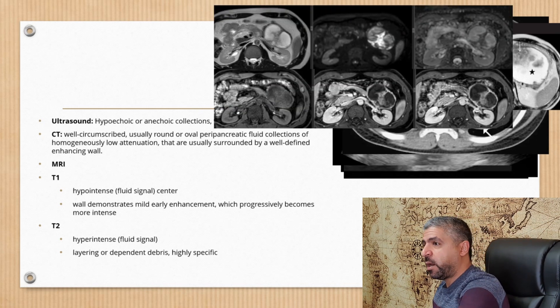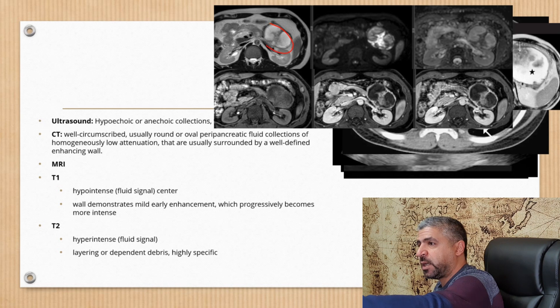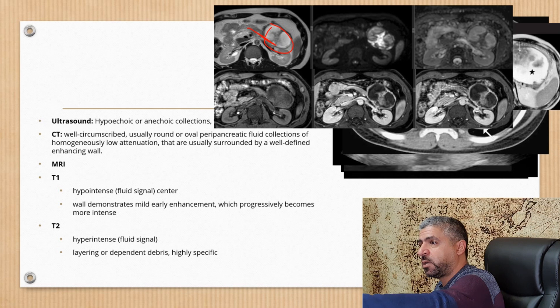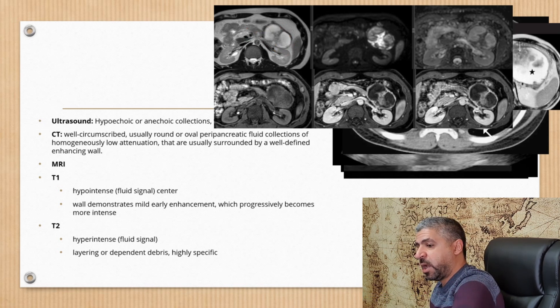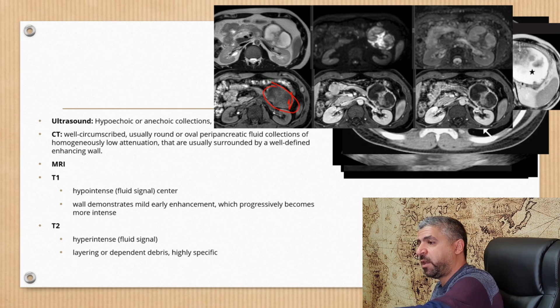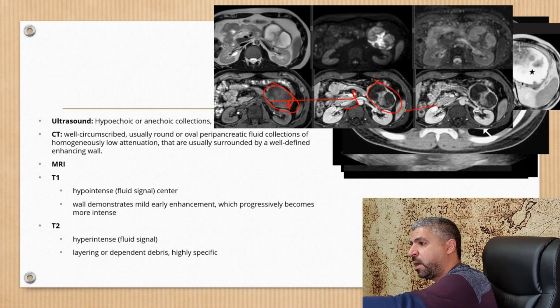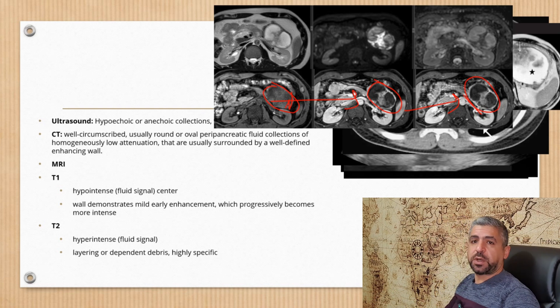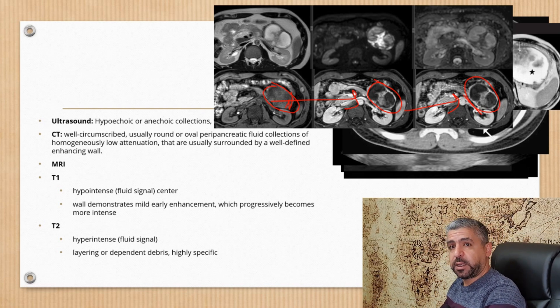On MRI, you can see a large cystic lesion with a thick wall containing internal debris, highly suggestive of pancreatic pseudocyst. Another example shows a cystic lesion with a thick wall just anterior to the tail of the pancreas, demonstrating fluid signal intensity on T2-weighted images and fluid signal intensity with a relatively thick wall on T1. When contrast is given, it starts enhancing, and a slightly delayed image shows even more post-contrast enhancement — this is in favor of pancreatic pseudocyst.